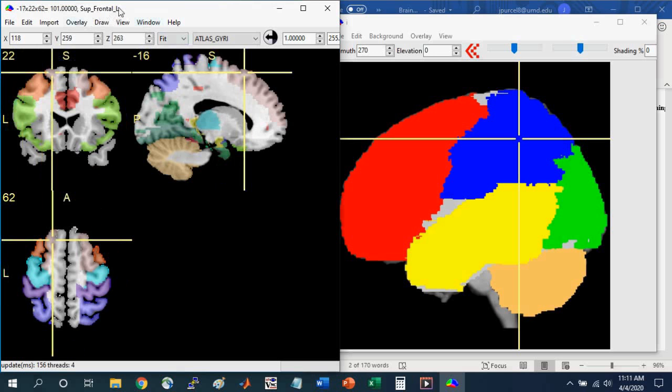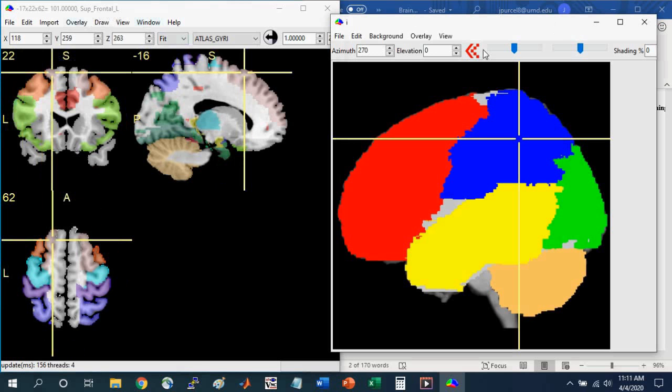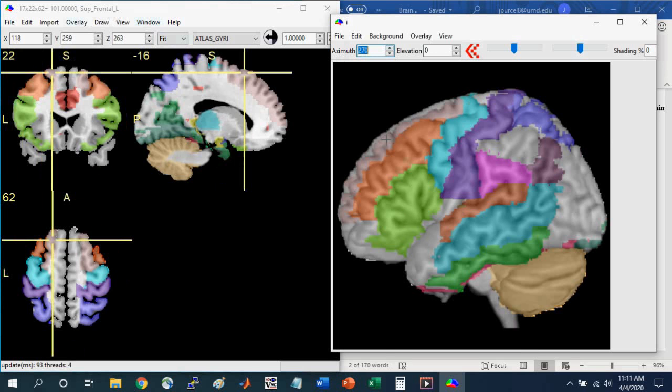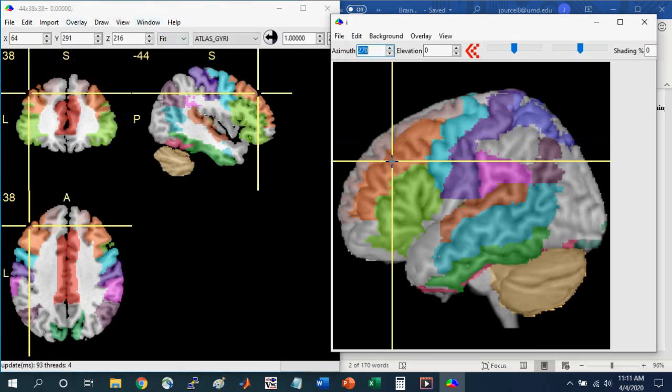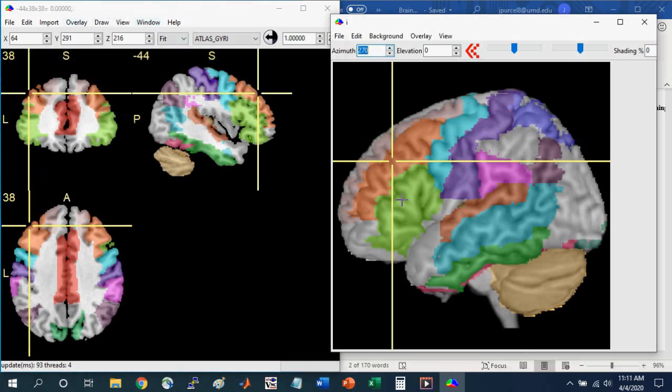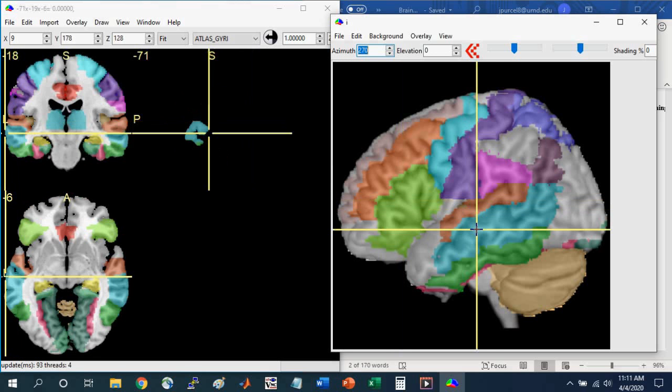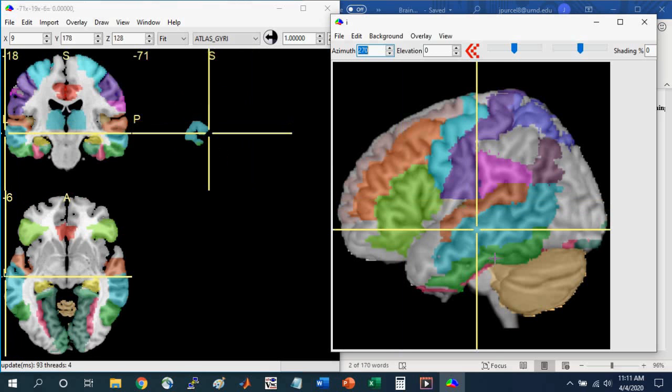And if you go back to the rendered view and make a change to, say, the azimuth, you can see these structures on the rendered brain. And so you can see the superior, middle, and inferior frontal gyrus. You can also see the superior, middle, and inferior temporal gyrus.